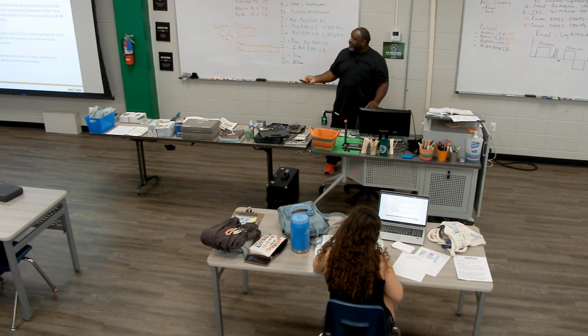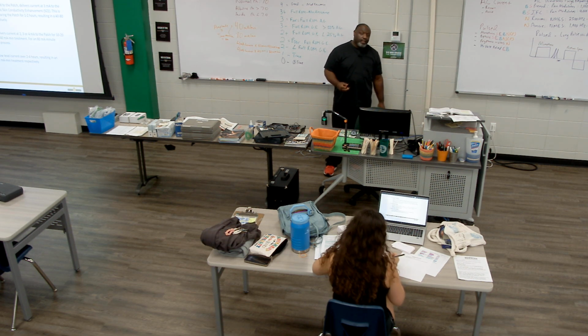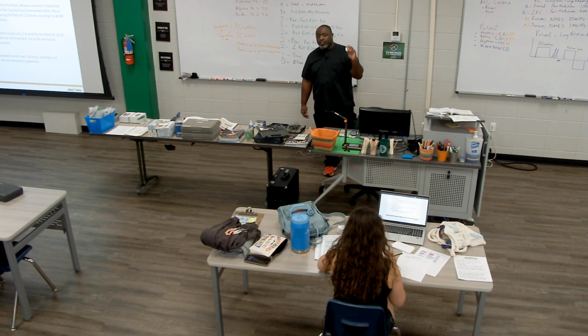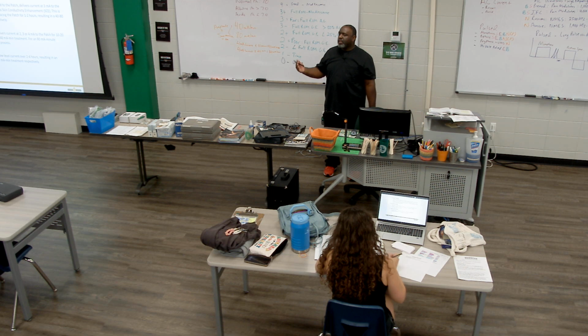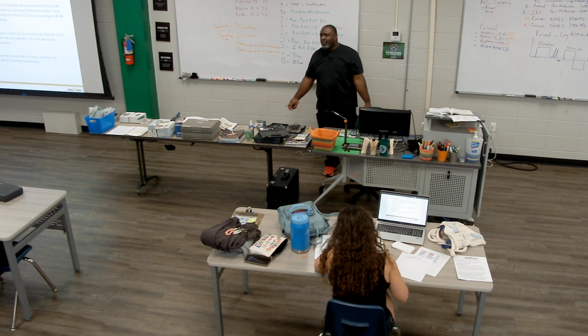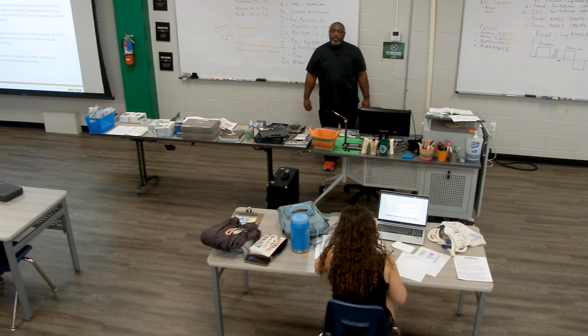You can do a standard treat like a regular Ionto, or you can just do patch only. And there's a lot of brands now, they've dropped the controller and they just do patch only. So I think you can buy patch only electrodes off of Walmart, I saw the other day. So there's more and more opportunities to use this if this is something that you find works for your patient.